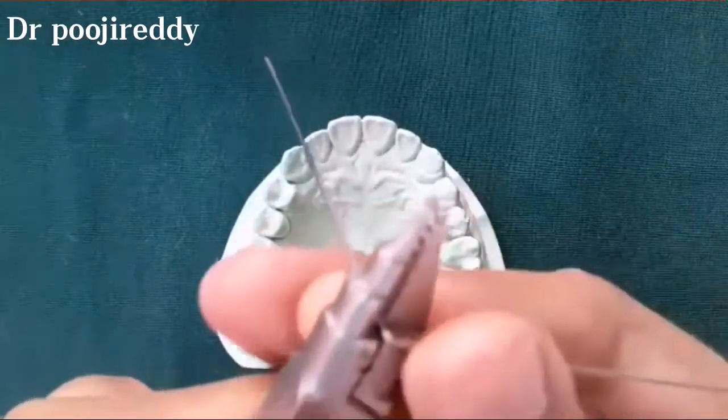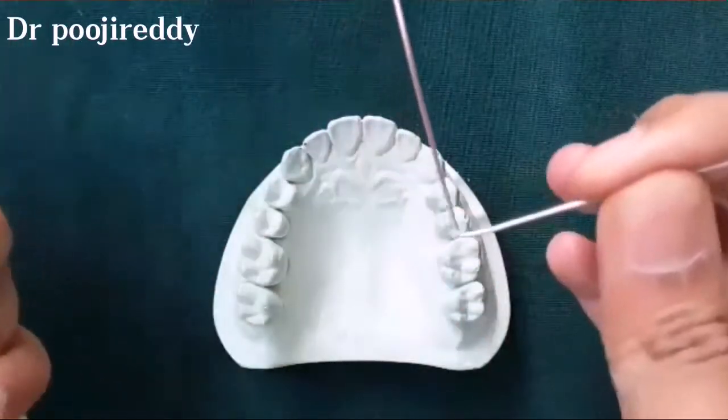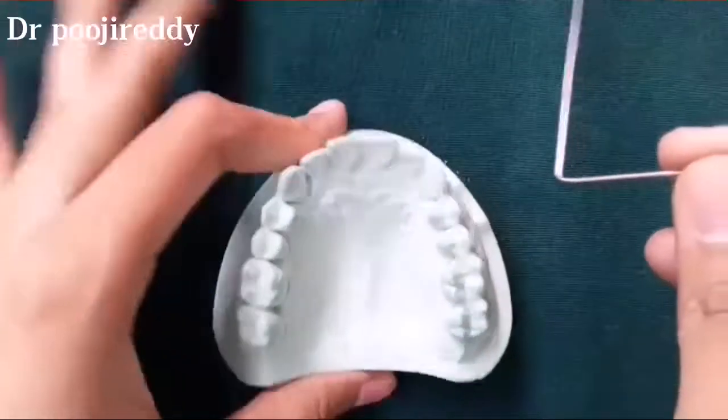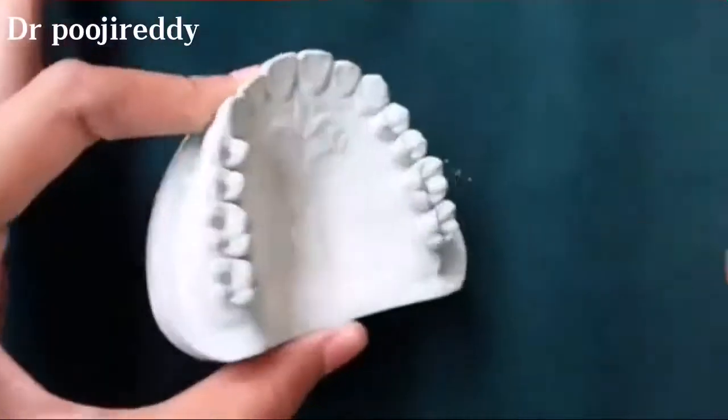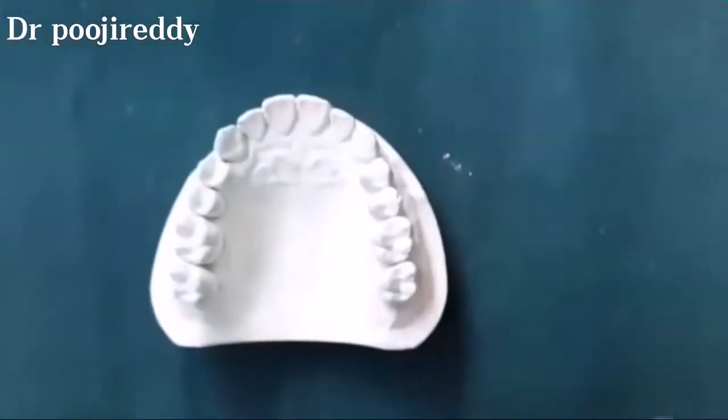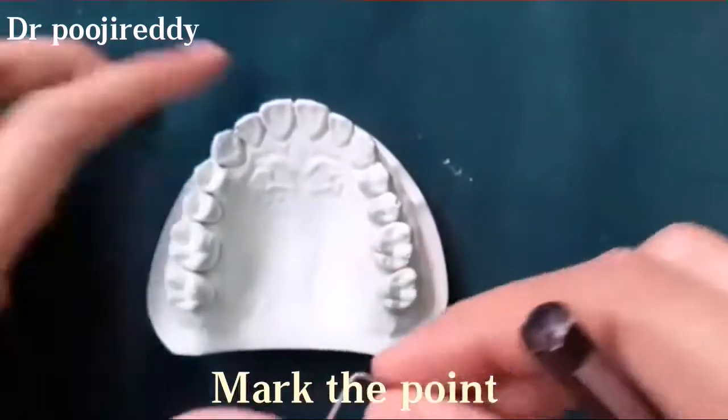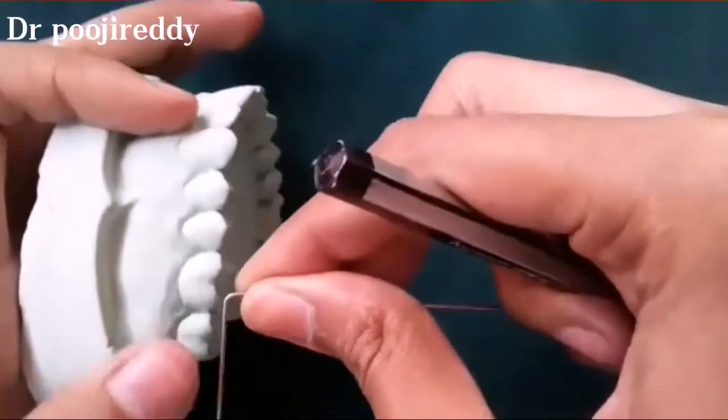The bend should be sharp. Now I am marking the second point, that is the mesial undercut. The distance between the mesial and distal undercut will be the length of the bridge.